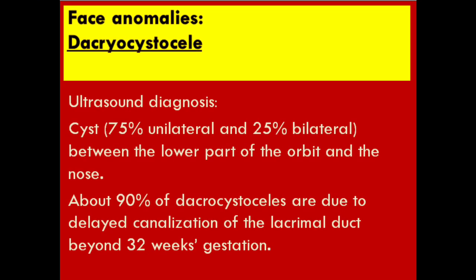The next is dacryocystocele. Ultrasound diagnosis: 75% unilateral and 25% bilateral, located between the lower part of the orbit and the nose. About 90% of dacryocystoceles are due to delayed canalization of the lacrimal duct beyond 32 weeks gestation.